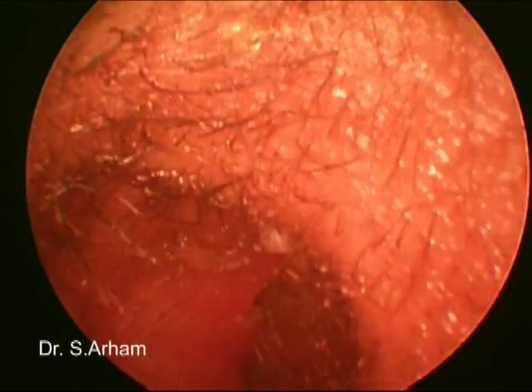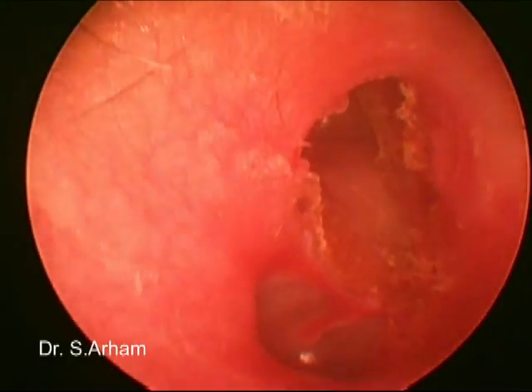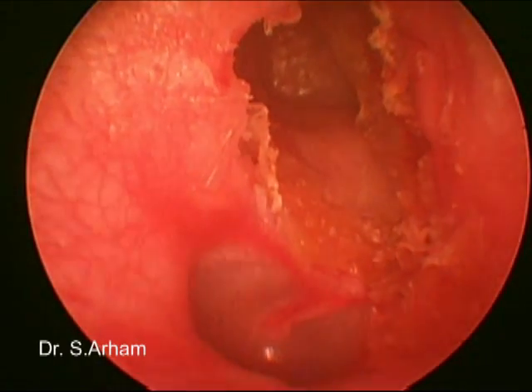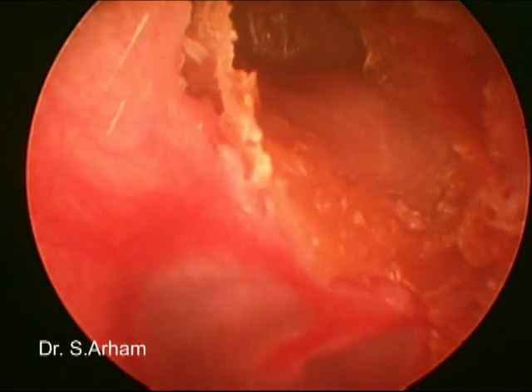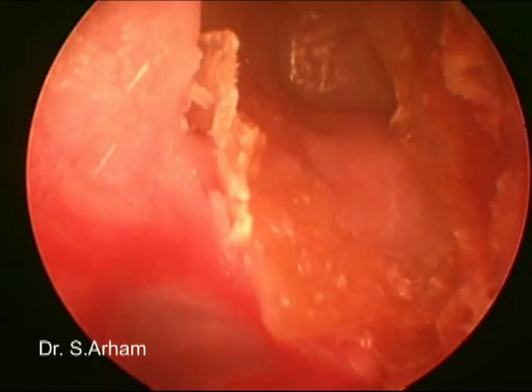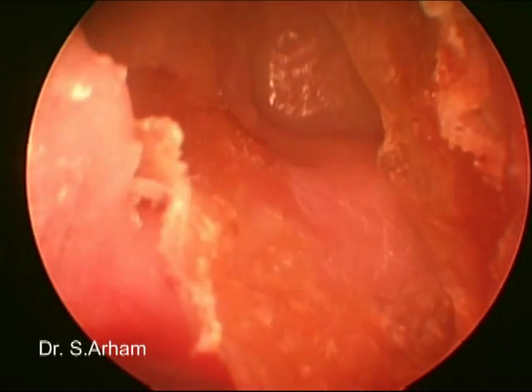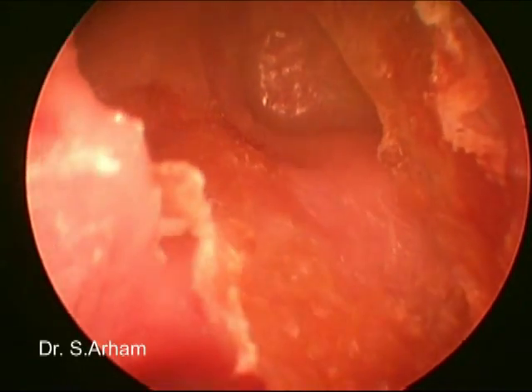The same curved instruments are required during the follow-up of a case done through an endoscopic approach. During the follow-up, we are using the halogen light with a three-chip camera. Most of the time when we are using halogen light with a three-chip camera, this gives a reddish hue to the video.